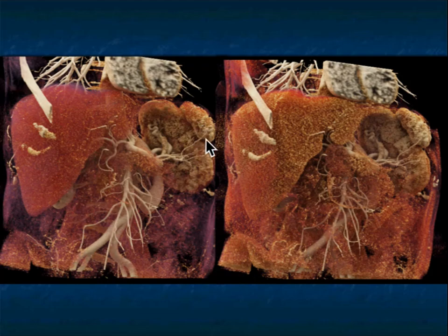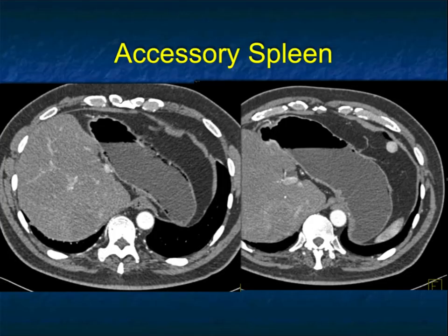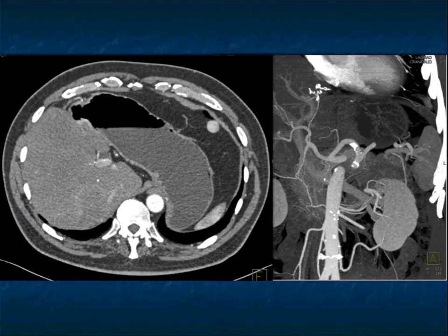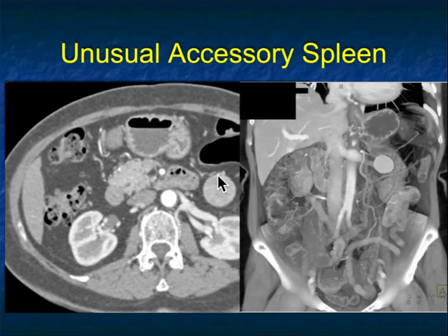On the same patient, a small splenic artery is visible; the lesion sits above the spleen near the stomach beneath the diaphragm. On cinematic rendering, the textural mapping looks identical for both structures. Some unusual accessory spleens are located further from the hilum, which is where errors occur — mistaking them for lymph nodes or, in oncology patients, implants. Some are large; one example sits beneath the pancreas near the left renal vein and is very vascular.